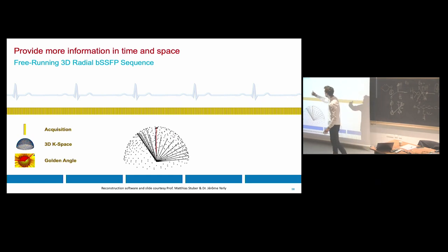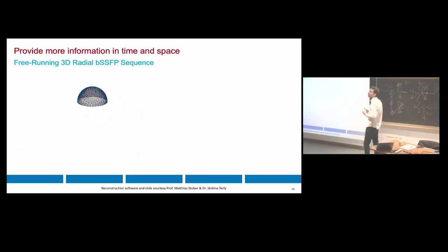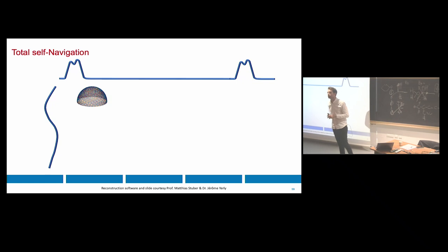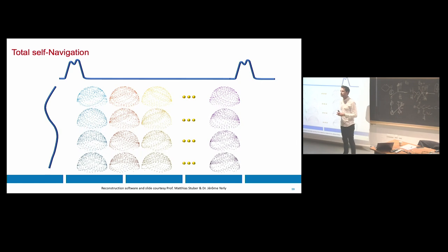So continuously, without electrodes, you'll get a 3D advanced K-space, and now you have to think about how you're gonna get the images. So you could bin this data set in the dimension that we want. We could bin the data set in the cardiac dimension and the respiratory dimension. You fix the number of cardiac phases, you fix the number of respiratory phases that you want. You have split the data in multiple K-spaces.